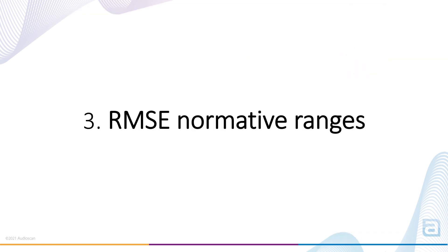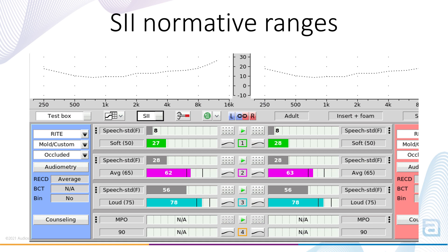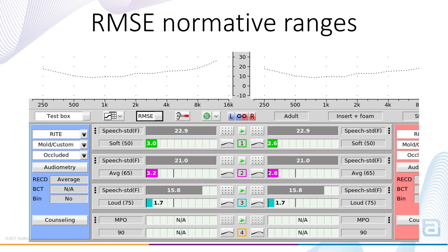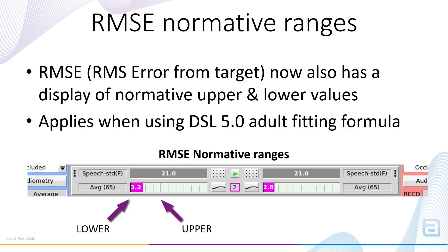RMSE normative ranges. A few releases ago the Verifit 2 added normative data for the speech intelligibility index, appearing as upper and lower limits in the SII Audit Bar when DSL child or DSL adult is the selected fitting rationale. The Audit Bar display can also be used to show the RMSE, or root mean square error from target. This value indicates the overall distance from fitting targets in the selected rationale and is based on values at 500 Hz, 1, 2, and 4 kHz. In the 2021.1 software release, normative ranges have also been added to RMSE for when DSL adult or child formulas are in use.